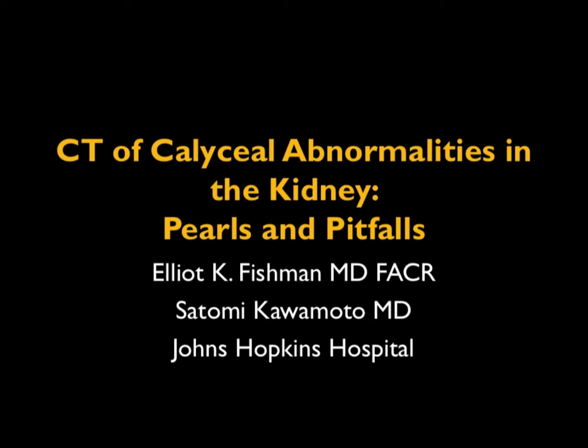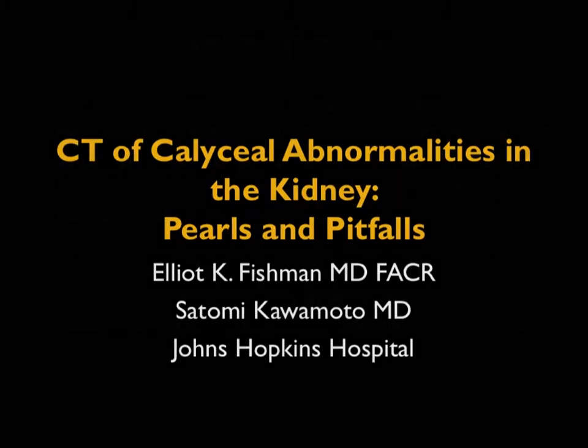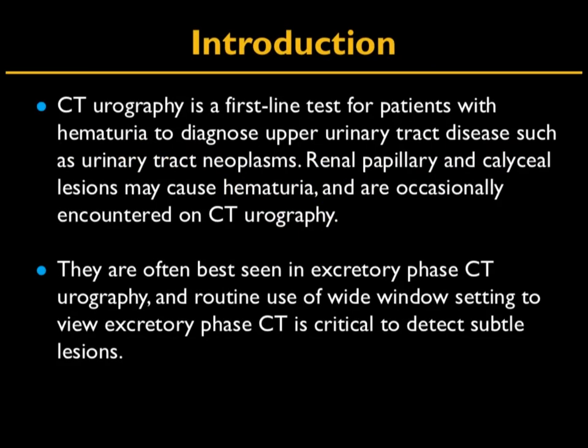This will be on calyceal abnormalities in the kidney, some pearls and pitfalls. Satomi Kawamoto did an amazing exhibit on this past RSNA, and this will include some of our material and a lot of what she's done. Her article is coming out in Radiographics, so you can look at it and see all the details. So we all do lots of CT urography.